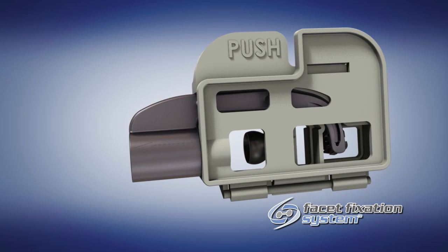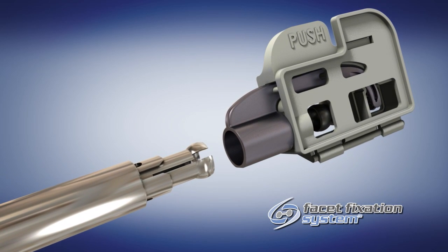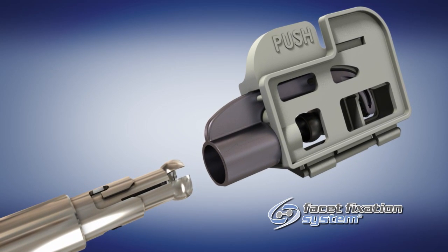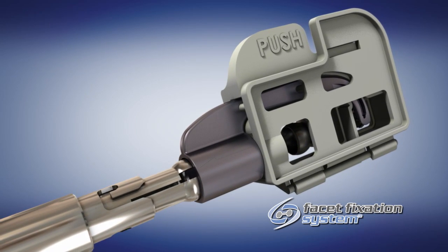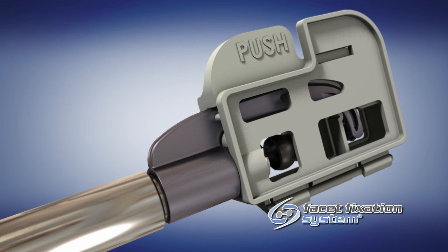Assemble the cassette onto the distal end of the barrel by threading the outer locking tube counterclockwise until the slots on the end of the barrel are exposed. Then insert the cassette onto the barrel by aligning the arrows on the metal bridge to the slots on the barrel.